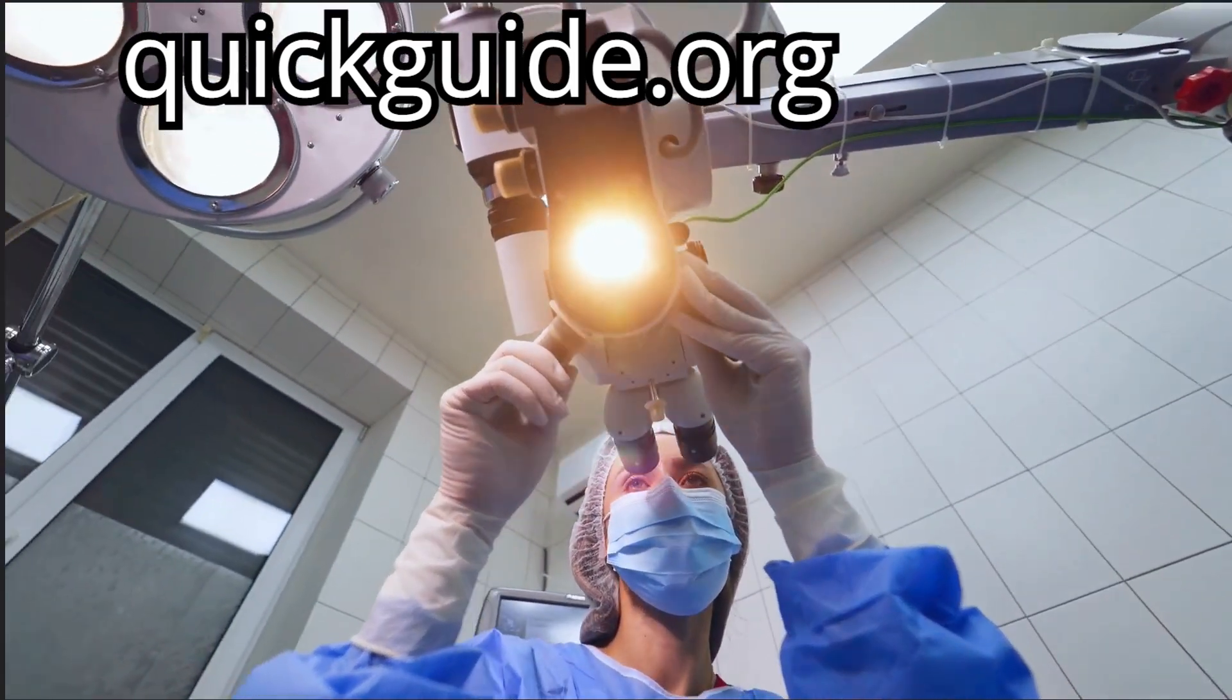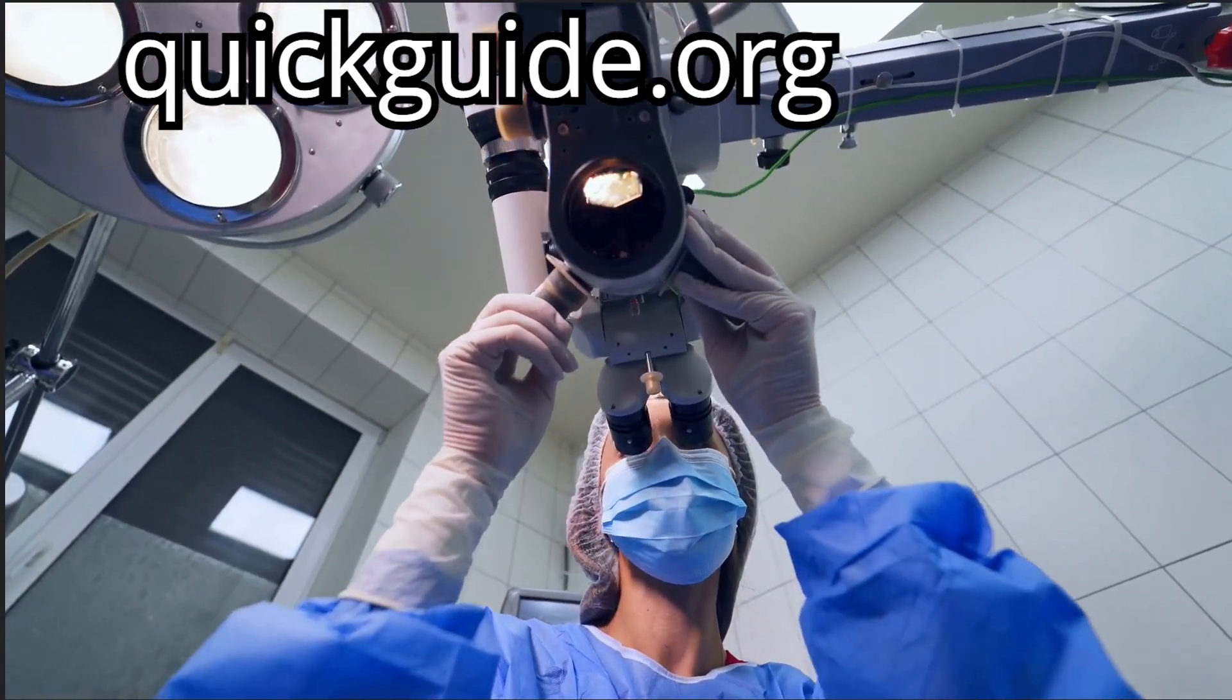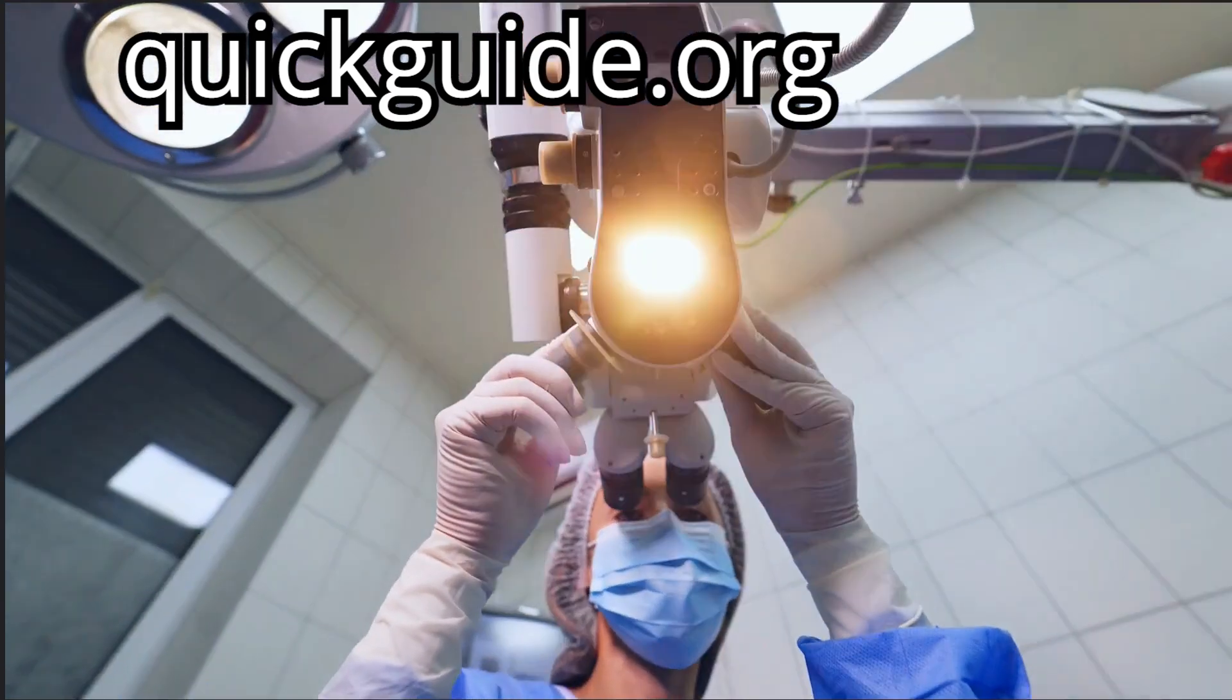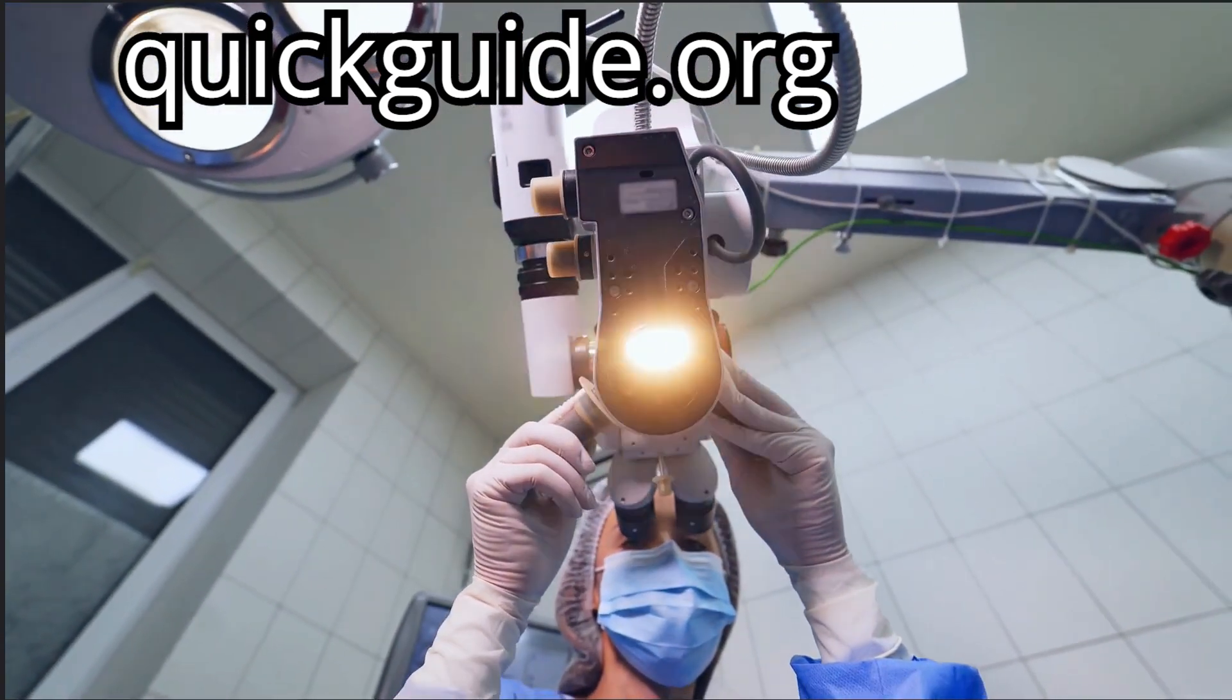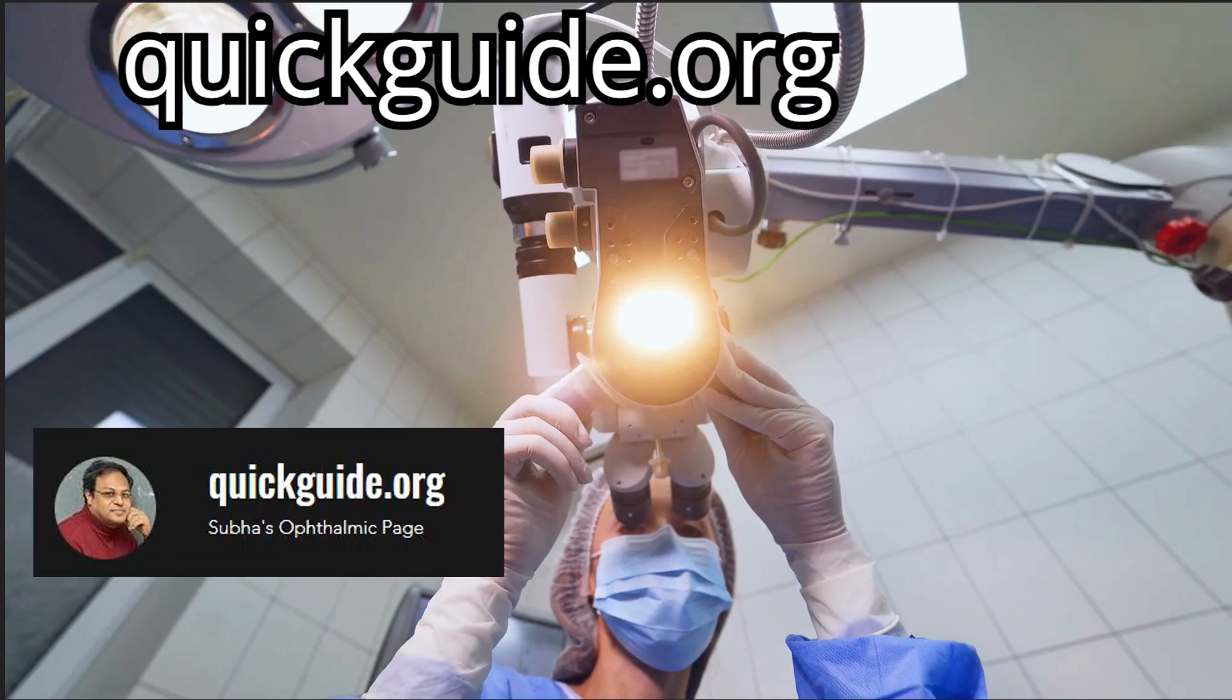The prolate or oblate cornea is identified in corneal topography by the shape factor or Q factor. Going forward with this series, we will talk more about Q factor and the choice of lenses. Keep following quickguide.org.